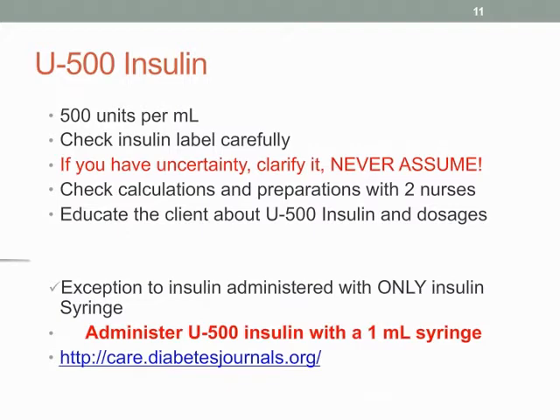And this U500 insulin is the exception because we usually say U100 insulin is administered with U100 insulin syringes only, never with any other kind of syringe. However, the exception to the rule, once again, is the U500. You use a 1 ml syringe versus an insulin syringe.